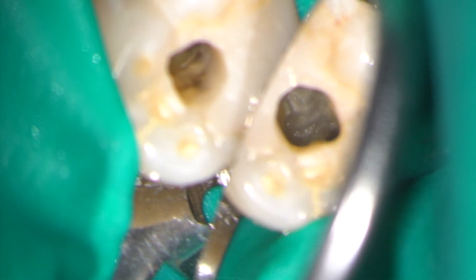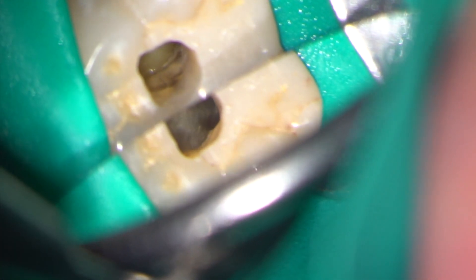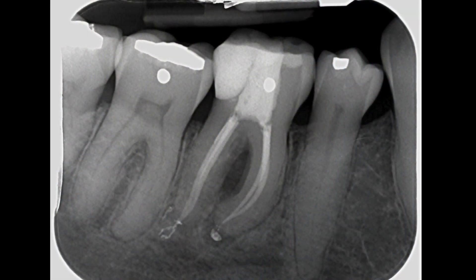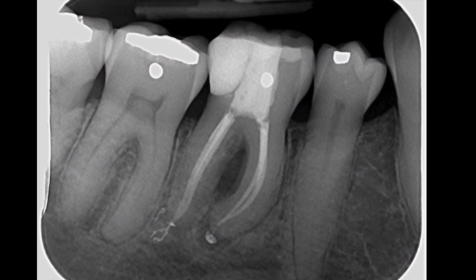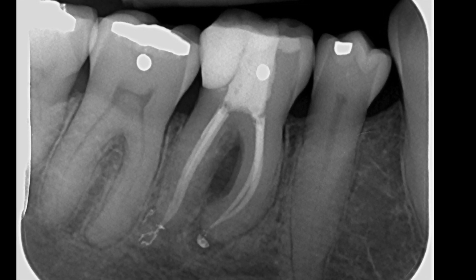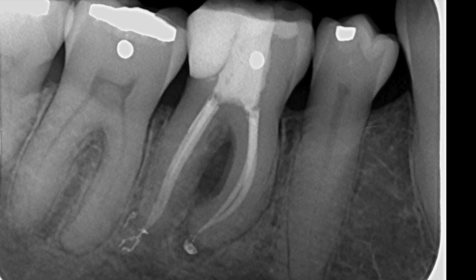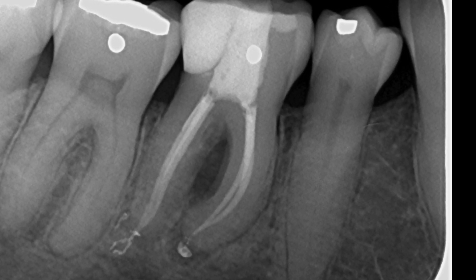The four canals have been dried before obturation with a vertically compacted gutta percha technique. I'm pleased with the final result which shows a good coronal apical seal. There's been a little bit of extrusion of sealer apically, but this will be absorbed in time. The first review will be done in about one year.